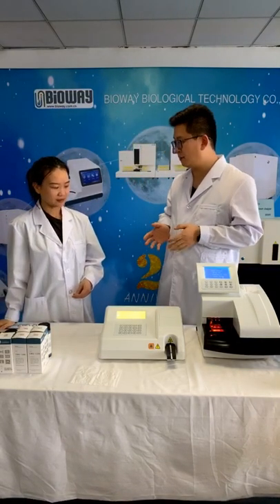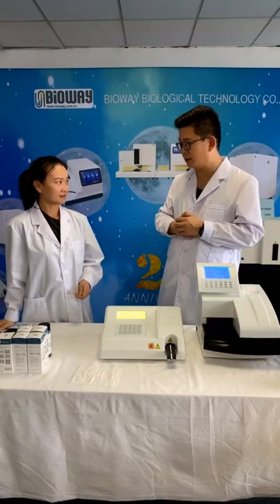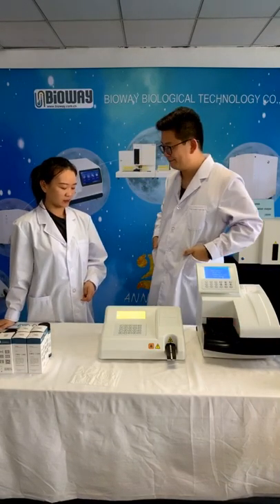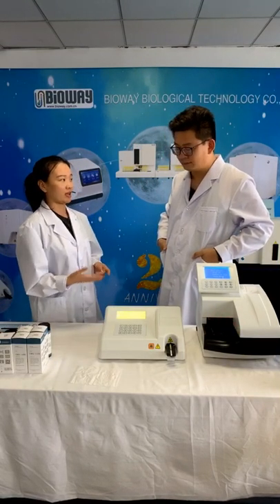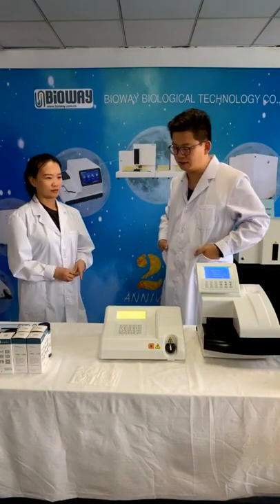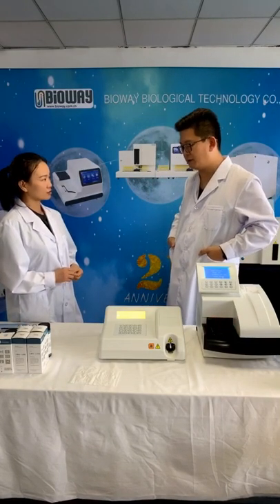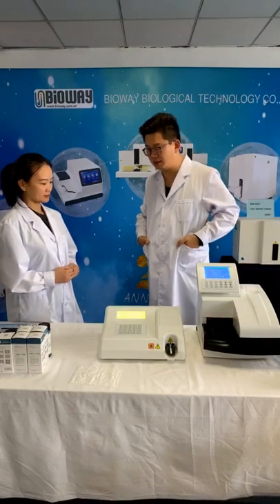During this waiting time, do you have some questions or expectations for this device? If I wanted to connect this to a LIS or HIS system, do you have a port or interface? Yes, of course. Later on, I will show you about the ports. They have different kinds of ports, like CAN ports and the like.